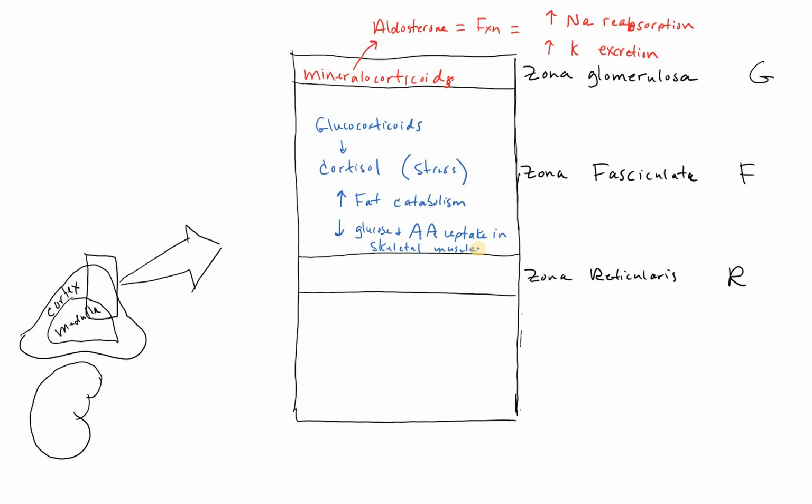So the glucocorticoids are released from the zona fasciculata.